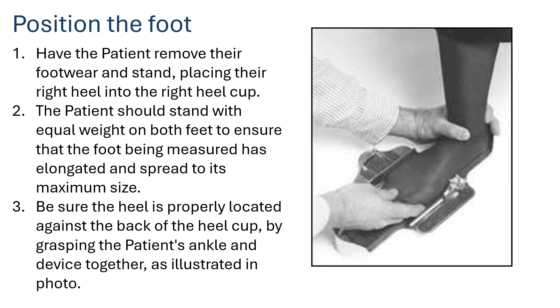If measuring the right foot, assist the patient by pressing down on the ankle and simultaneously pushing the Brannock device towards the ankle to ensure there's no gap. The patient should stand with equal weight on both feet so the foot being measured elongates and spreads to its maximum size. You may need to assist the patient to ensure their feet are well spread — if the foot is curving or not spreading, structural deformities may affect measurement accuracy.